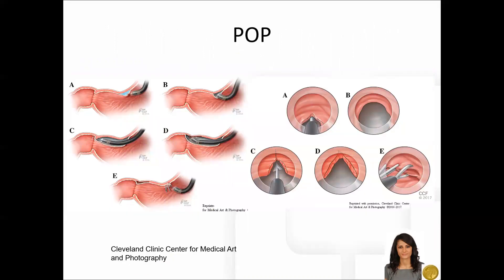The POP procedure was then performed in the standard fashion. A diagnostic endoscopy was performed without passing the scope through the pylorus to reduce tissue trauma. A submucosal bleb was created two centimeters proximal to the pylorus on the lesser curve, followed by a two centimeter transverse mucosotomy. A submucosal tunnel was created, the pyloromyotomy was performed, and the mucosotomy was closed with clips. Immediately following the pyloromyotomy, FLIP measurements of diameter and distensibility were again performed in an identical fashion to the initial assessment.